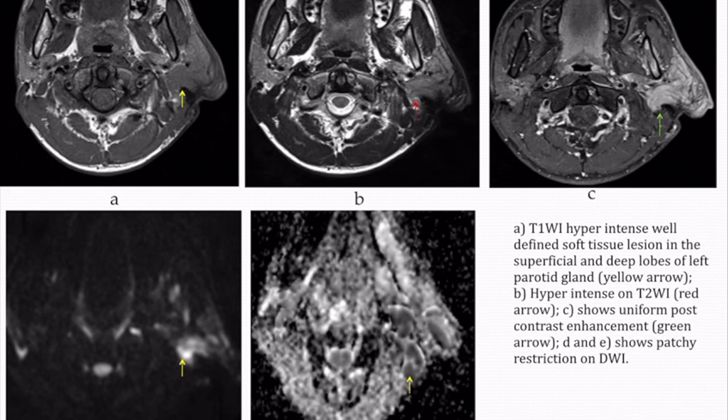Axial MRI images showed a T1 hypo-intense well-defined soft tissue lesion in the superficial and deep lobe of the left parotid gland, hypo-intense on T2-weighted images, with homogenous post-contrast enhancement and patchy areas of diffusion restriction. This was a known case of Kimura disease, with parotid gland involvement by the same disease process.